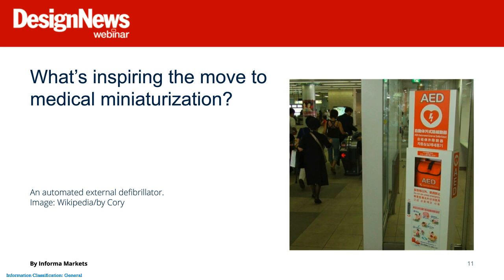was still big and bulky, and it was only capable of delivering one stage of treatment. And that stage was a massive electrical wallop of about 720 volts. Before those early implantable units would go off, they would warn the patient by sounding a buzzer so that the patient would have time to get down on their hands and knees before the therapy hit them. So patients obviously were terrified of these episodes. Some of them banded together in support groups, and they even asked their cardiologist to remove them, preferring the risk of death over the actual therapy itself.